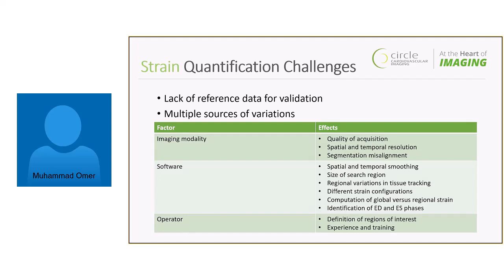Another software-related factor is the detection of the two important phases, which may be plus or minus one or two phases in the identification.